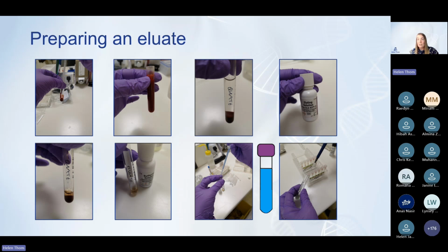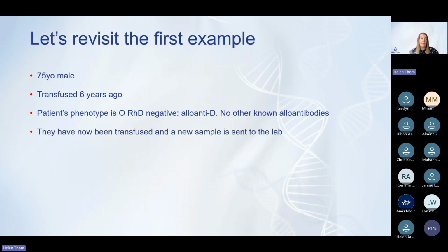So you're keeping that acidic supernatant, but you need to put a buffer in it. There's a buffer that is blue, and you add it again drop by drop. Once it reaches the point of neutralization, it turns blue, and you've got to neutralize it because it's acidic. If you didn't neutralize it and you put it in your red cells, it would lyse them, so your result would be invalid. And then you just treat it as though you would plasma, and you do your antibody ID.